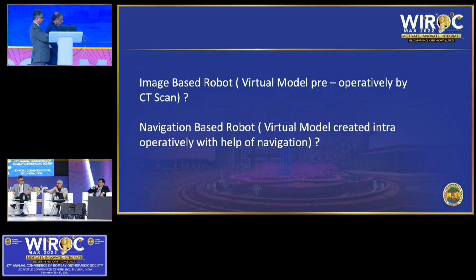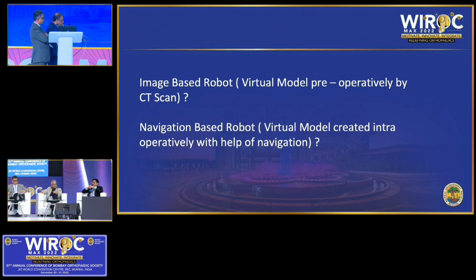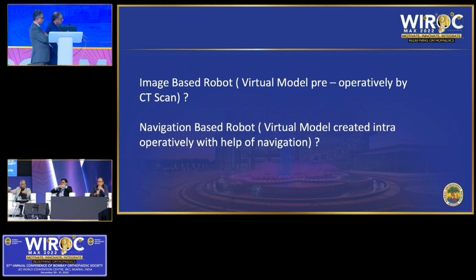Yes, in your practice. Tejas? Even I was a navigator to begin with, so it was easier to move to an imageless system. And also I feel the time pre-op which you need to spend for an image-based system would be more. Rather, I would spend more time in the OT on my screen to plan the knee. And again, though people are saying that the image would be more accurate, there are osteophytes in there. And because you've been navigating for quite some time, you're quite confident about your registration, so you can go ahead with an imageless system.